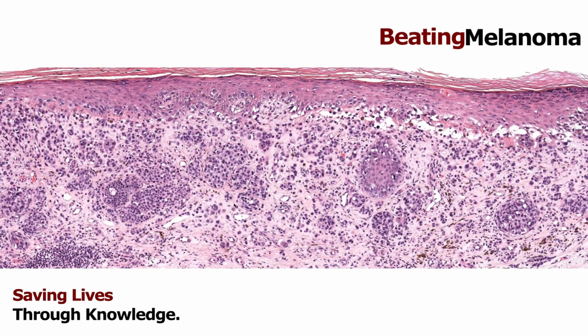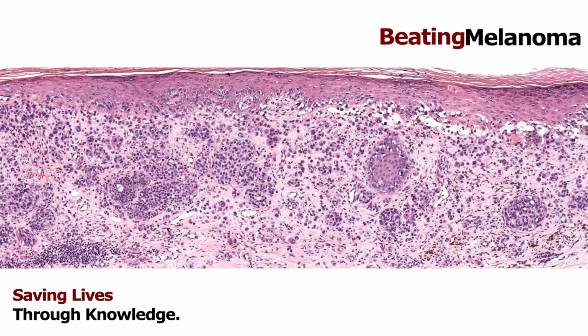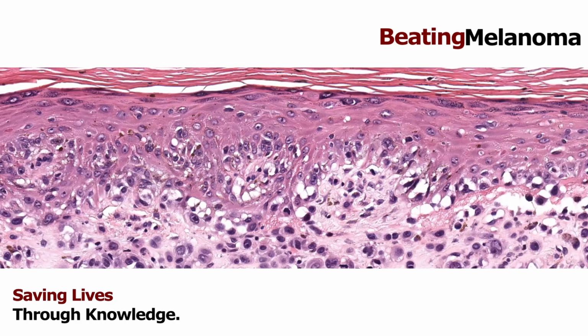And so for the Breslow thickness, what we do under the microscope, I actually have this little part right here. It's called the ocular. I have a separate one that has a little tiny measuring stick inside of it that shows me how big 1 millimeter is. And so I swap that out and look at the slide under the microscope. I don't have one here to show you, but what we do is we start at the very top part, not the top of the flaky dead layer, but the part where these purple little granules are. We call this the granular layer of the epidermis. So I start at the top of the granular layer and I go down to the deepest invasive cell.